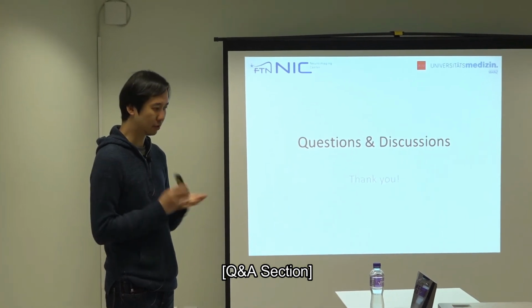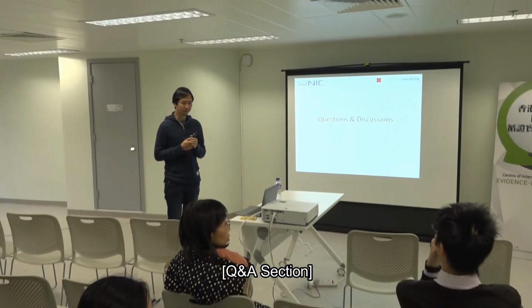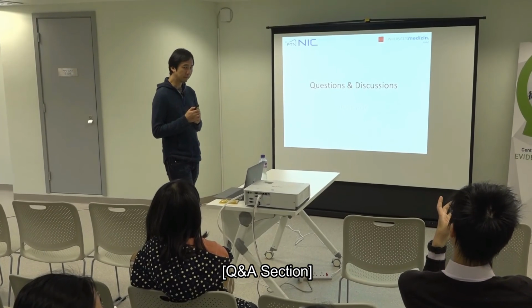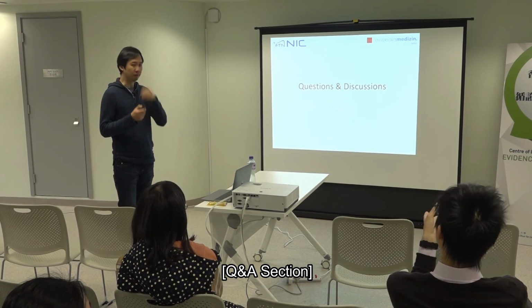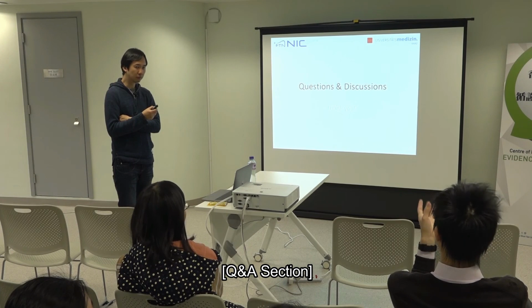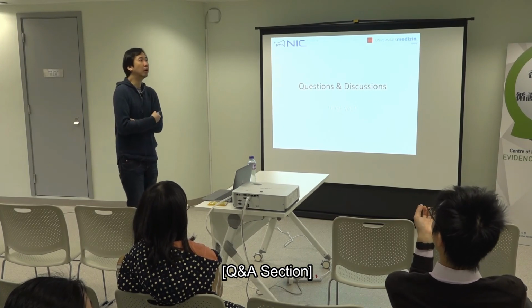or discussions? Can you talk about the TMS? There is a discrepancy in the function between 1 Hz and 10 Hz. One of them is depression, and another is potentiation. Mm-hmm. So is there any explanation why the different intervals will trigger such different results?